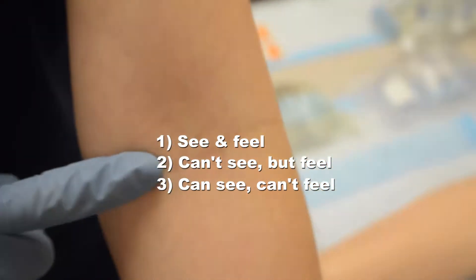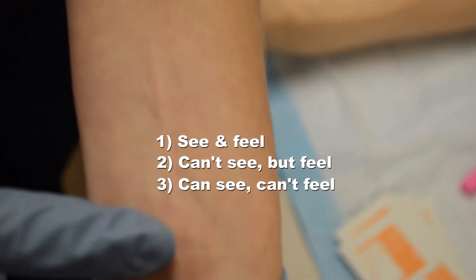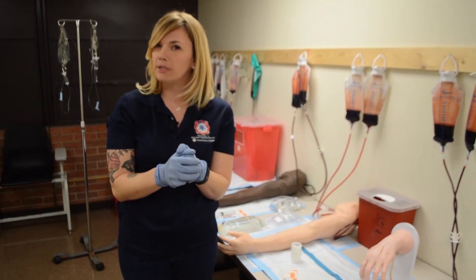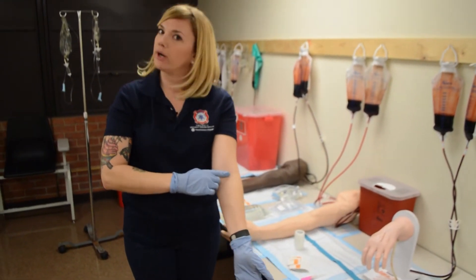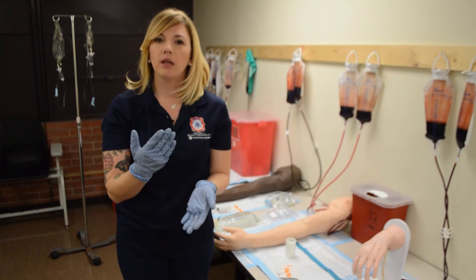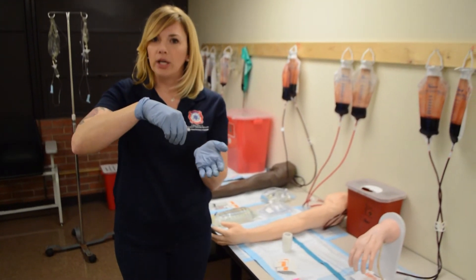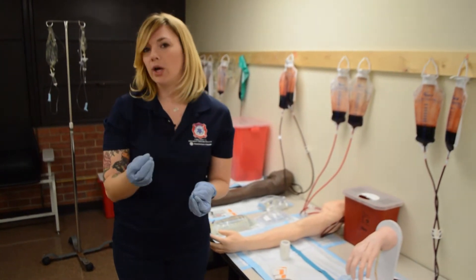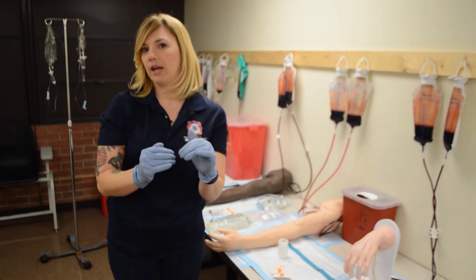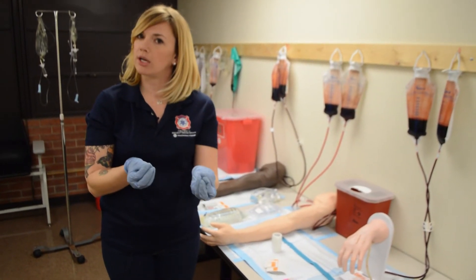So: ones that we can see and feel, ones that we can't see but we can feel, and ones that we can see but not feel. The more obese your patient may happen to be, you need to push a little bit harder because you have more tissue to pass through — the vein may not be just right under the surface but maybe a little bit deeper. But skin itself is not very thick, so we don't need to go at some crazy angle with our needle. It's basically just to get under the skin — poke quick, hard, and fast. Once we are in, those nerve endings are at the skin level and also surrounding the vein, so we shouldn't be causing much pain once we're inside, and at that time we can readjust a little bit.